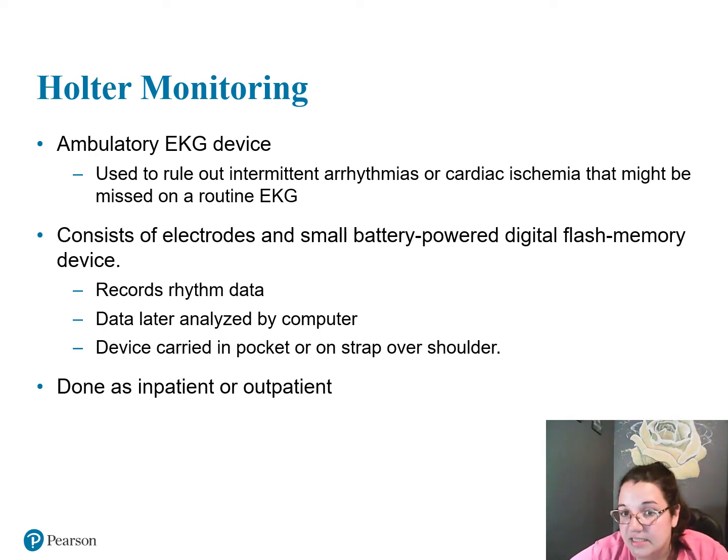And these are basically, this gives the patient the freedom to move about. So if you do a resting EKG, your patient's going to be lying down or in a seated position. They're not really able to move at all, other than relax and breathe. But for my stress test, they're connected to the machine. They're doing exercise, so they really don't have too much movement. They can't take the electrodes with them as they get off the machine, right? And go down the hall to the restroom. So we have what's called our Holter monitors.